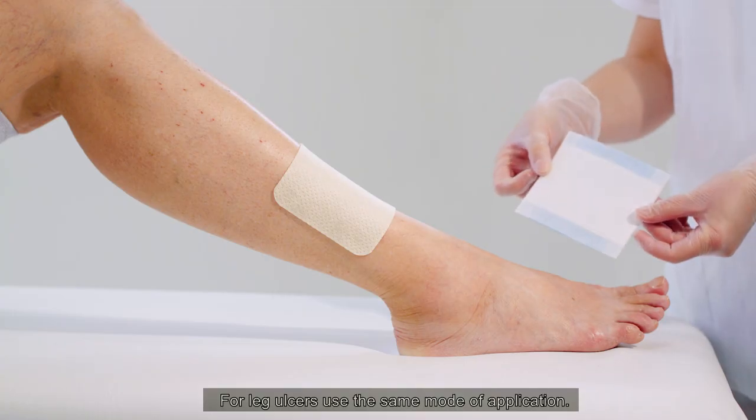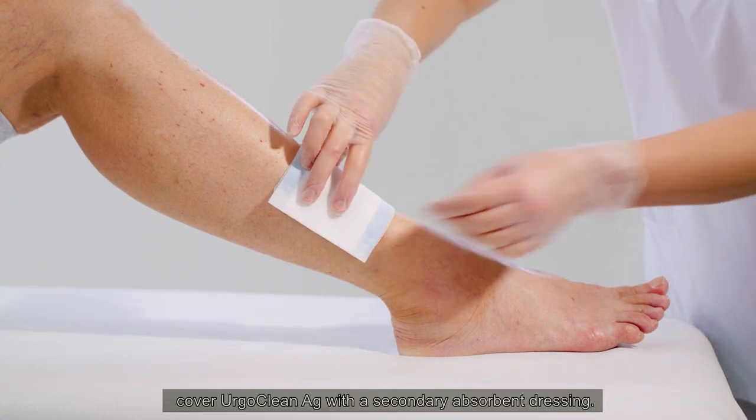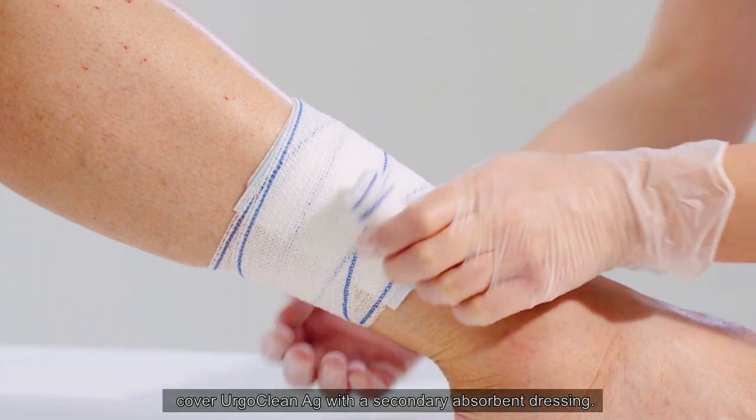For leg ulcers, use the same mode of application. For highly exuding wounds, cover UrgoClean Ag with a secondary absorbent dressing.